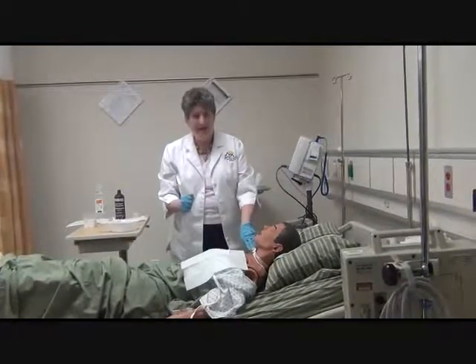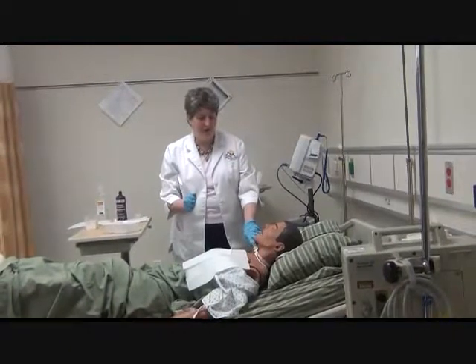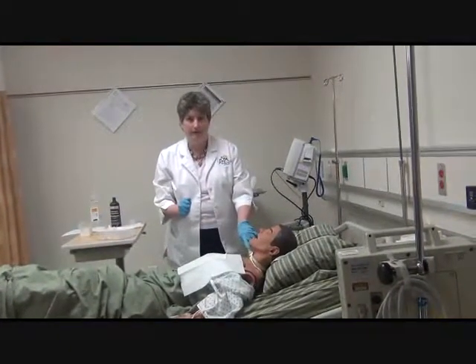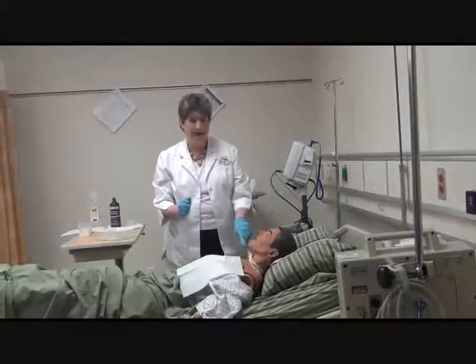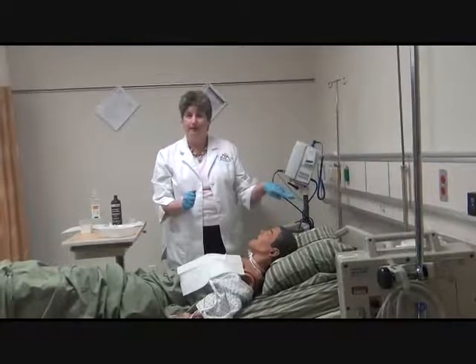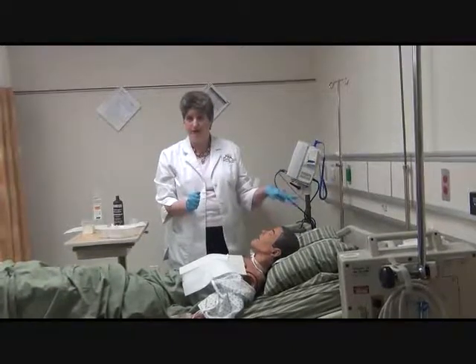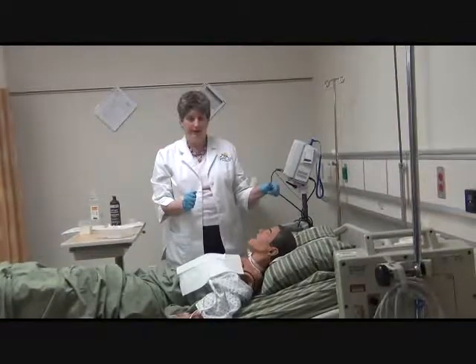You should always, at the bedside of a trach patient, have an extra trach. You should also keep the obturator present at the bedside. I suggest taping it actually to the bed, because the bed will go with your patient if they go to x-ray, surgery, or someplace else. So we should always have a backup trach.